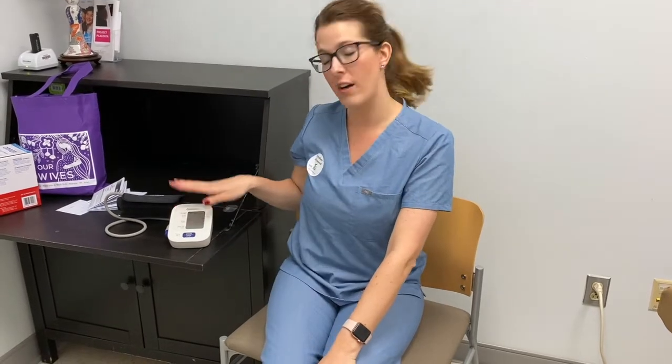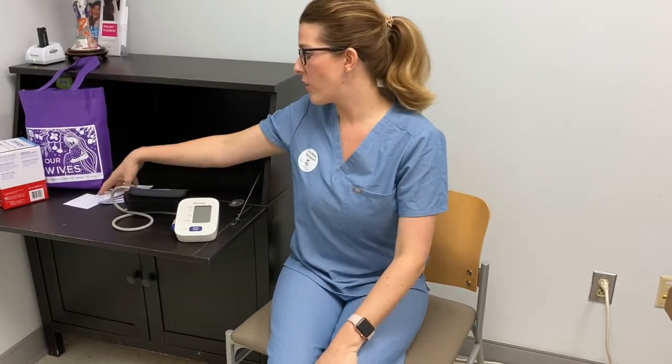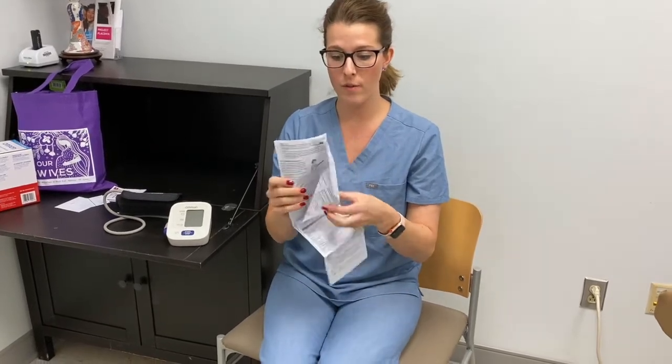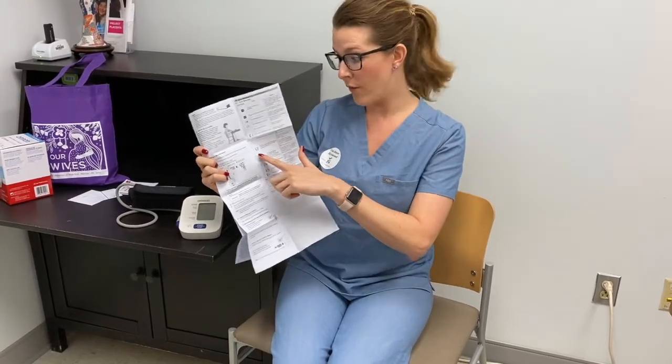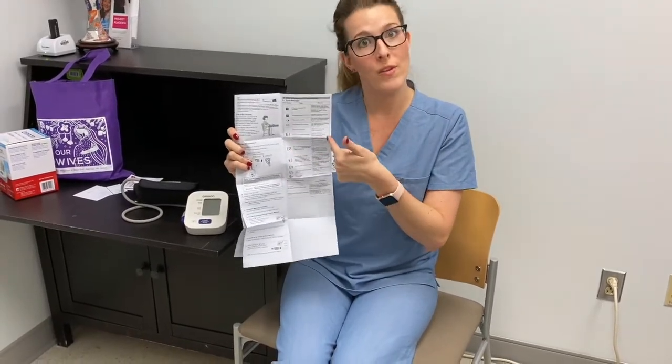Hey guys, a couple more things about the blood pressure cuff. One, if you get an error message, like I did, I would want you to just retake it and see what you get. Also, if it gives you an error message, which came up as E and then a number, you can refer back to your manual here and it tells you what that error means. So for example, E2 means I was moving, okay? And this just tells you kind of how to fix the problem.